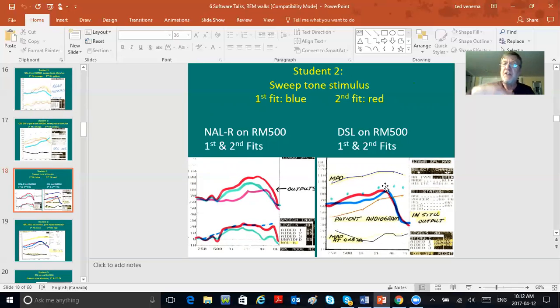Go on to today's real ear. Okay, speech mapping. So minimal audible pressure or 0 dB HL. Client's audiogram. Maximum power output or UCL, the most you'd ever want. Here's the targets in the center of the dynamic range, so you know it's DSL4. Program the hearing aid on the manufacturer's software according to DSL4.